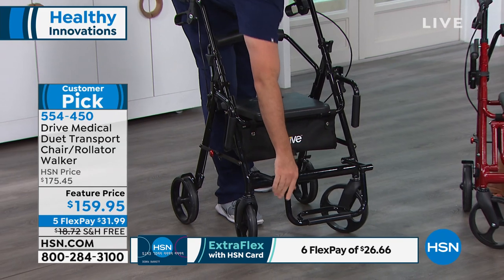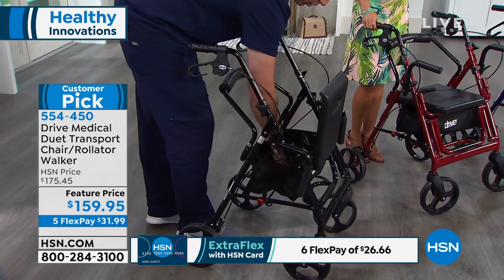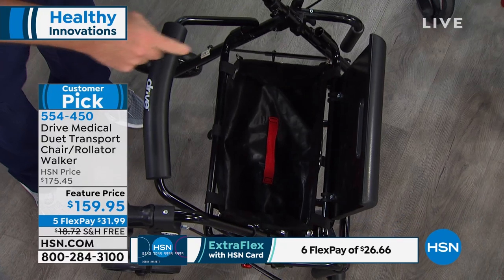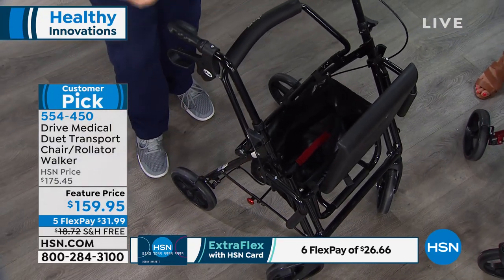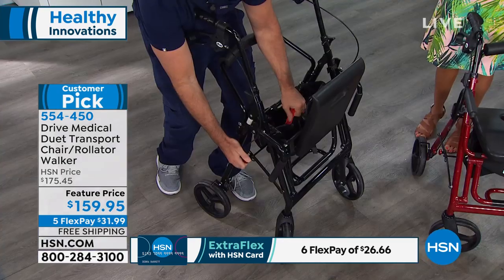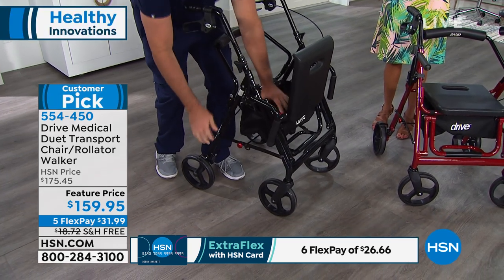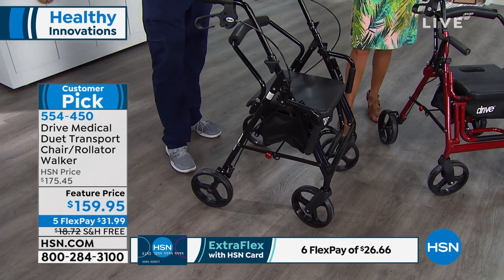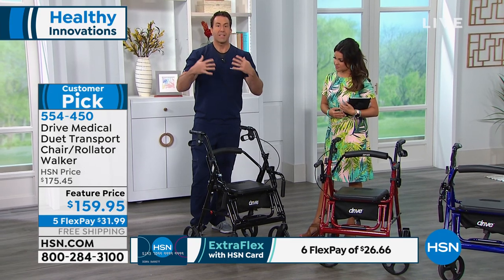I fold the footrest in underneath. Under the seat you have all this storage room. There's a red handle in here — it associates with the red safety pin, making it very visually easy for you. I'm going to pull up on the red handle and pull on the red safety pin at the same time — you see how it starts to fold up and hinge. That's the ingenious aluminum design. It'll lock in a closed position and also lock in the open position. You hear that audible click so you have the confidence to know your Duet will remain closed when you need it closed and open when you need it open.